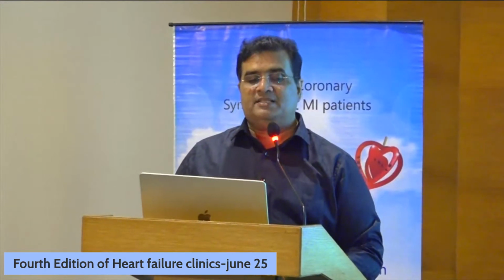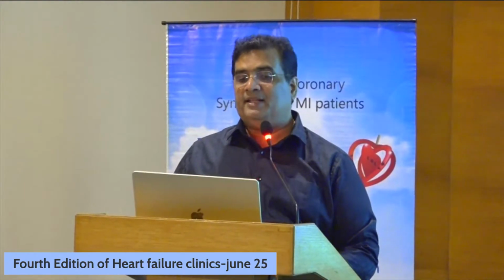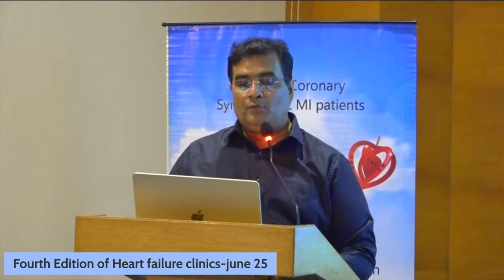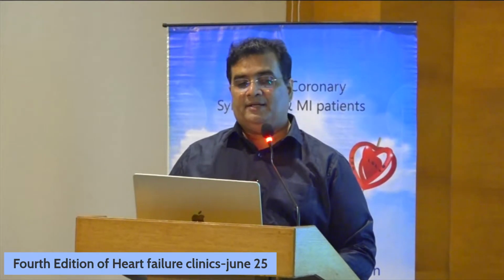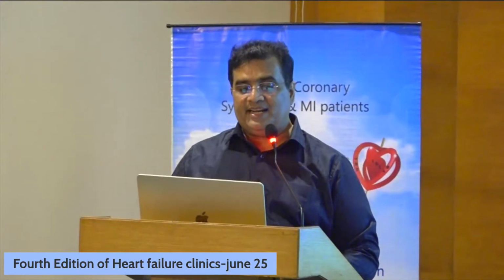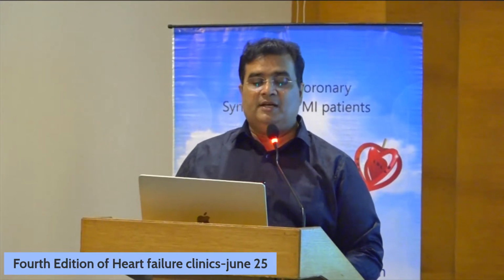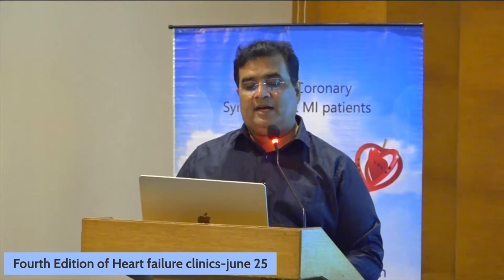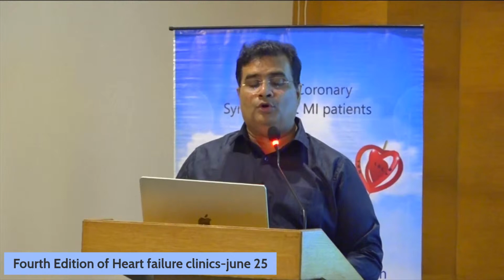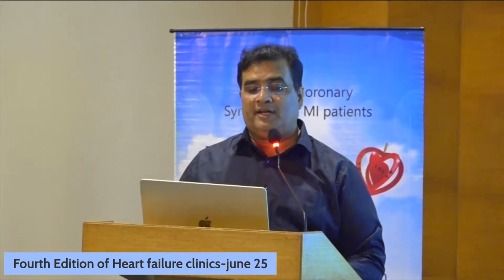So PET is the way we assess myocardial viability in the current day. There are multiple radiotracers, but what we use is FDG PET. The half-life is around 2 hours, and it indicates metabolism, and also the presence of inflammation. We have some other tracers, like 13N ammonia, which can be used for myocardial blood flow. So 13N ammonia for myocardial blood flow, FDG PET for myocardial metabolism.